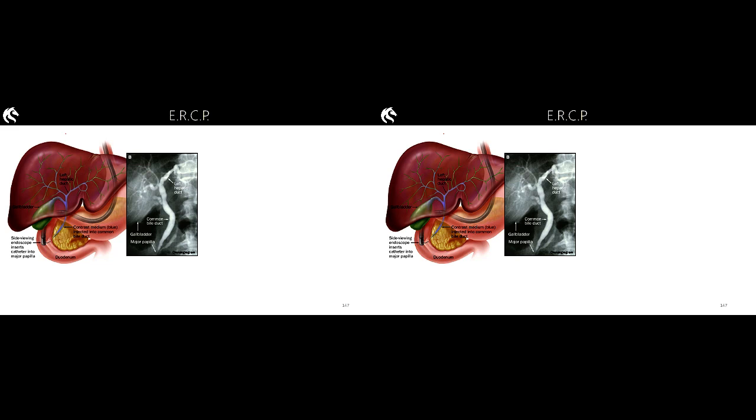When a patient is in an ERCP examination, there is a certain amount of art as much as there is science to knowing how much anaesthetic to give a patient, how much sedation to give a patient. And so these patients will have a variable level of consciousness. For some patients, they're particularly receptive to anaesthetic, and so a tiny, tiny dose will bomb the patient out completely. Other patients will require a fairly strong amount of anaesthetic to be able to be sedated.